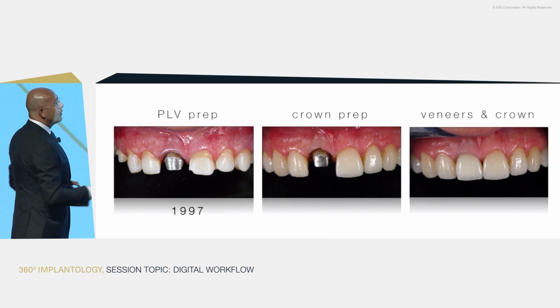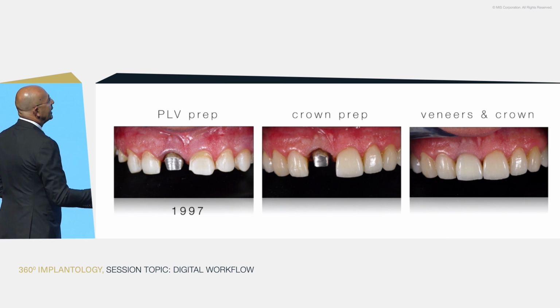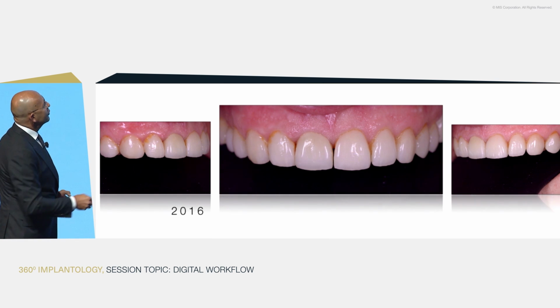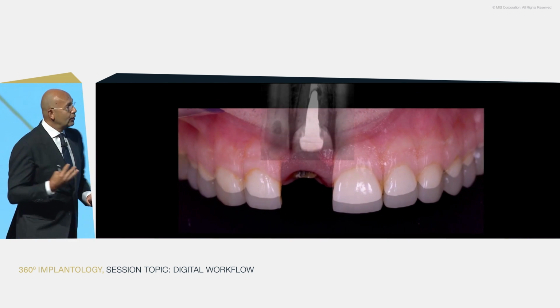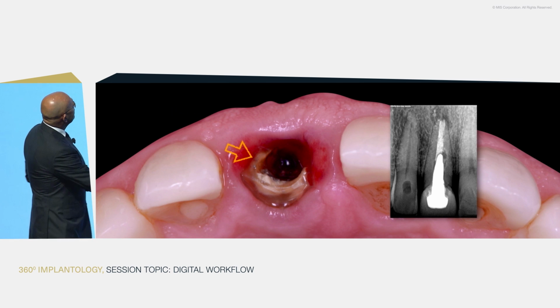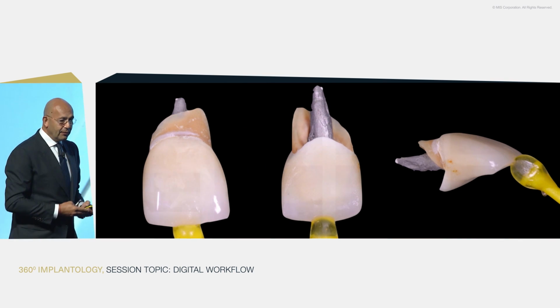Unfortunately, that was a crown, a very heavily cemented post. We just prepped through that, which was okay. And this is him this year, but this was just before he broke this central. But this time, it was broken badly. And what happened here is that besides the part we're missing, there's a huge crack in that part, which means the tooth needed to be extracted.